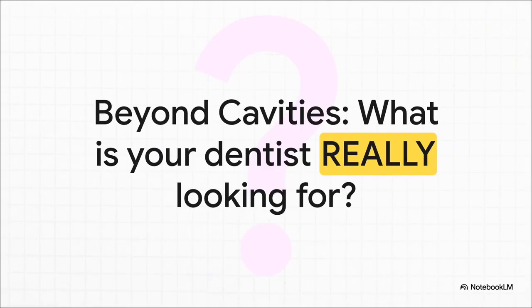So that's the big question. What is your dentist actually looking for? You gotta think of them as a detective, and that X-ray, that's their number one clue. They're piecing together a story, the story of an old injury you forgot about, or the body's super quiet response to a problem, or just the subtle changes that happen deep inside a tooth over your entire life.